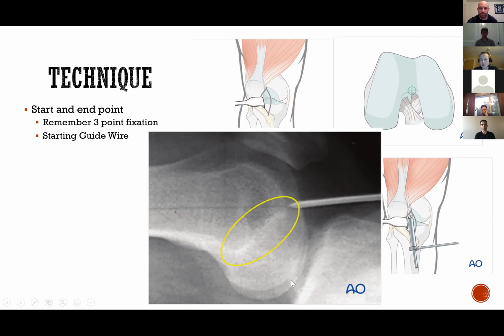So here you can see here's one condyle shadow and here's another, and they're off by a little bit. If you imagine this leg is horizontal in space and the C-arm is in line with your eyes right now, so you're looking through the knee. If you were to rotate that knee, internal or external, you can imagine how these posterior condylar shadows would change relative to one another. So the problem with this one is the rotation of the femur is off by a little bit.